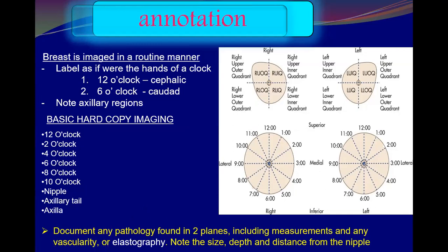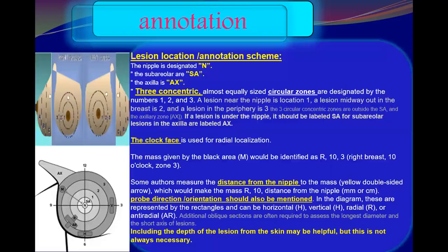We have to include measurements. We have to include any vascularity or elastography, documented and not just mentioned in the report. We have to capture the image. And we have to note the size, depth, and distance from the nipple. We'll go through that.